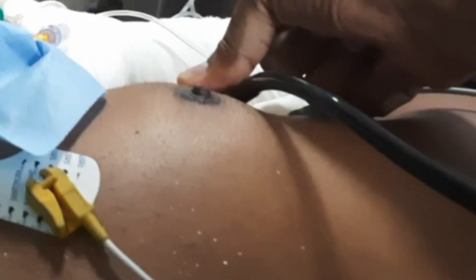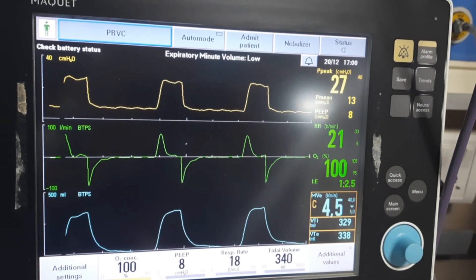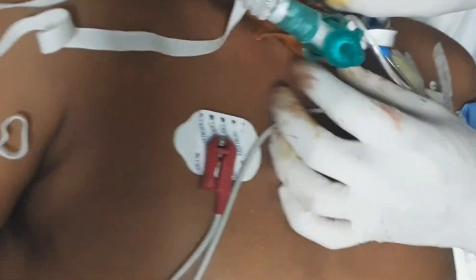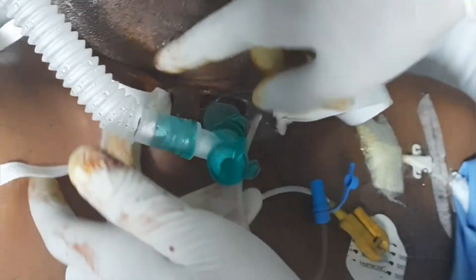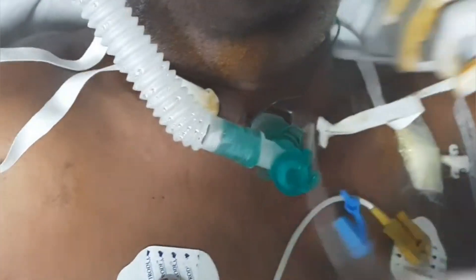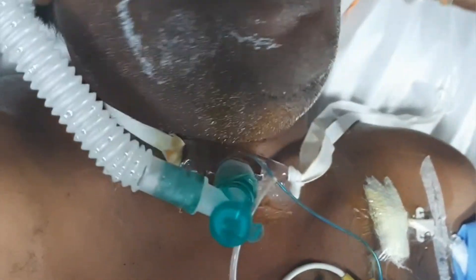We will attach the ventilator and inflate the balloon. Now we will check whether the tracheostomy tube is in the correct position. We will auscultate both sides to see if air entry is equal. We will also check the ventilator — see, a beautiful scalar waveform is coming and tidal volume is normal. Now we will tie the tracheostomy tube: we take a gauze piece with betadine, wrap it around the tracheostomy tube, and tie both sides around the neck. There is no need for sutures — this is sufficient. The procedure is completed.